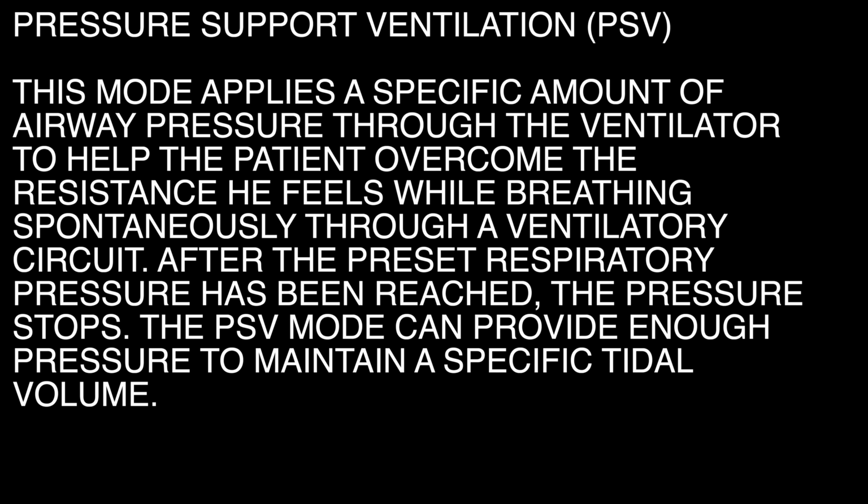The PSV mode can provide enough pressure to maintain a specific tidal volume. The pressure can then be decreased gradually, based on the patient's responses. The PSV mode is used to supplement IMV weaning and T-piece weaning by ventilator.